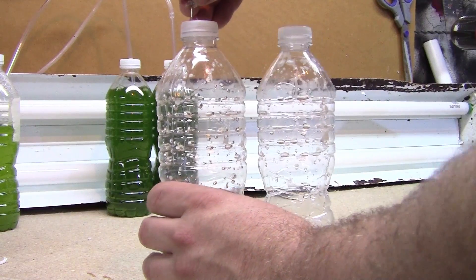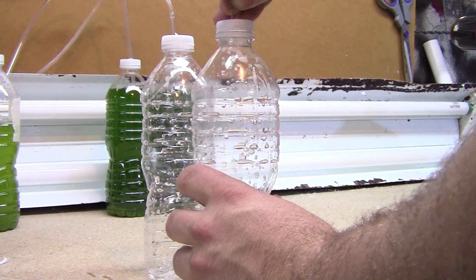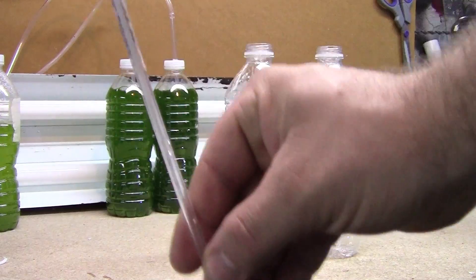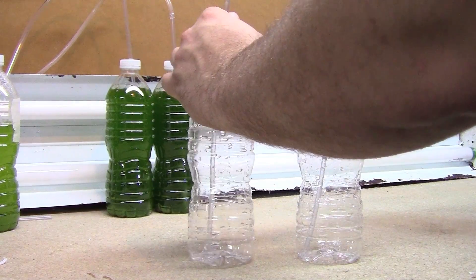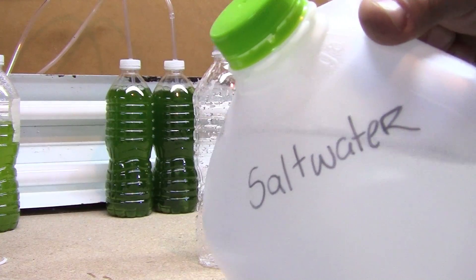I use a tack to puncture a small hole right next to where you just drilled. The reason I do this is if the air cannot escape from the vessel, it will build up and you can have explosions, or the air will stop entering the vessel and your cultures will die off.